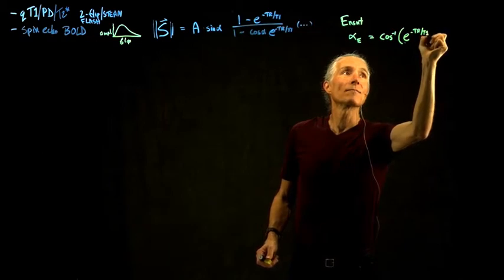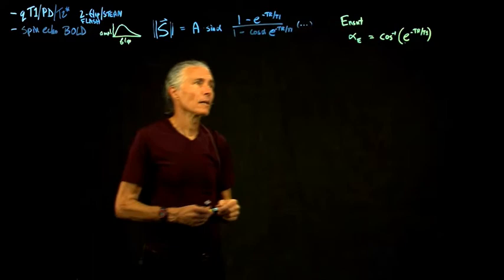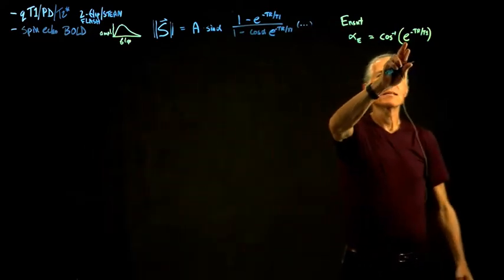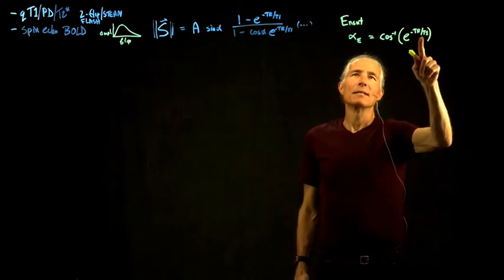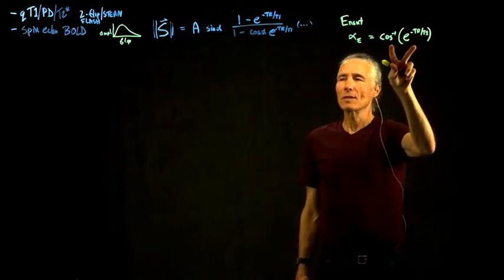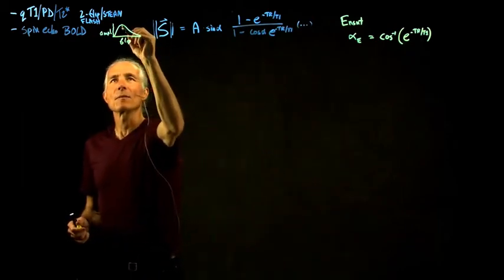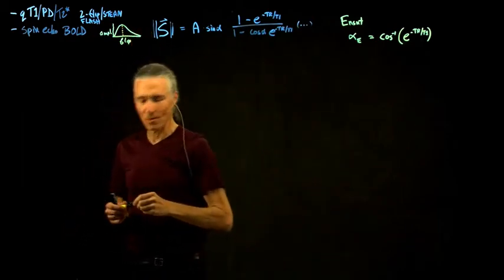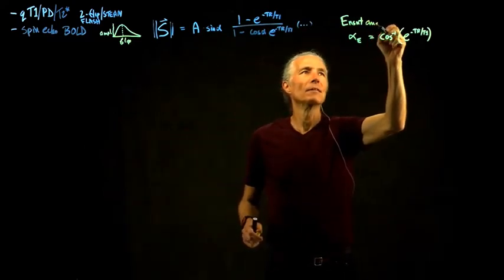So to find a flip angle, you have to know what the T1 is, but if you know approximately what your T1 is, then using this equation you can figure out what flip angle will give the maximum signal. So that was just a little side; sometimes that's called the Ernst angle.